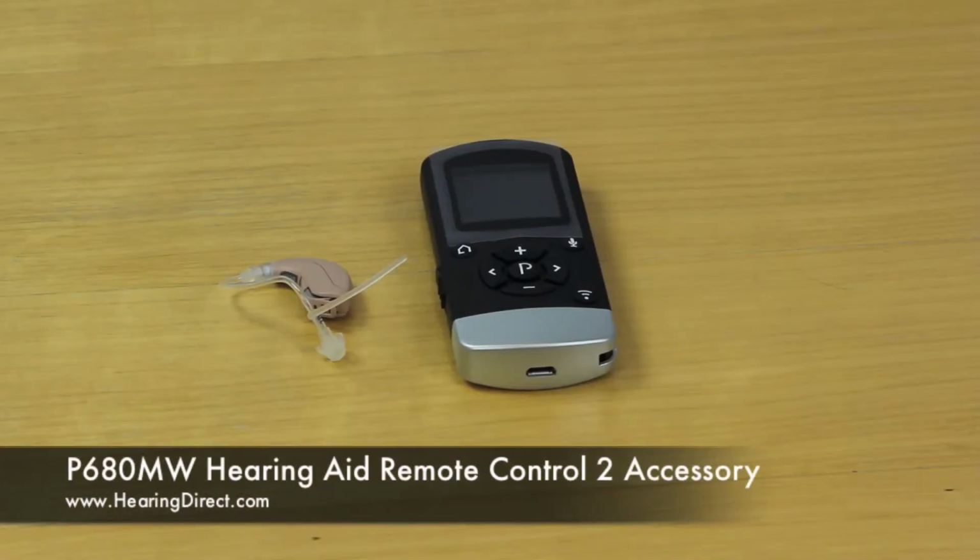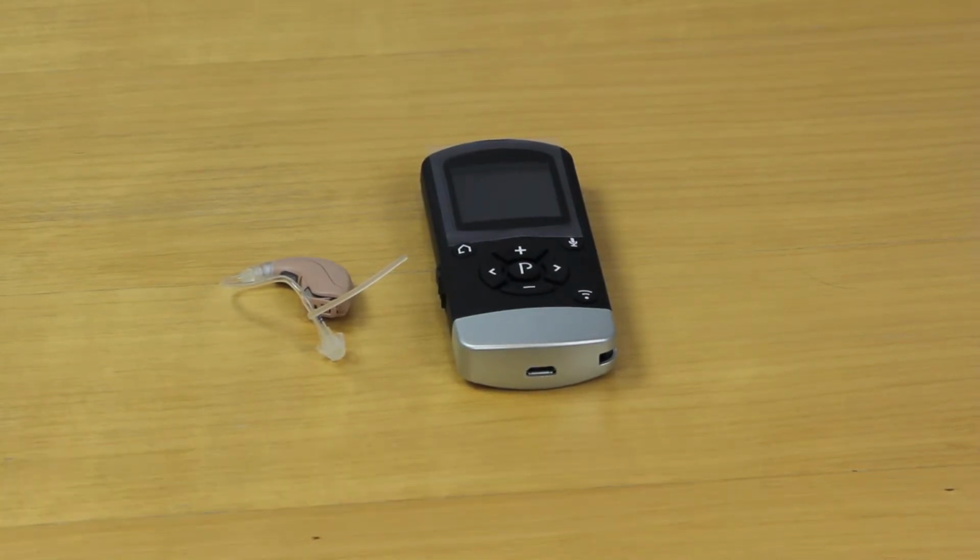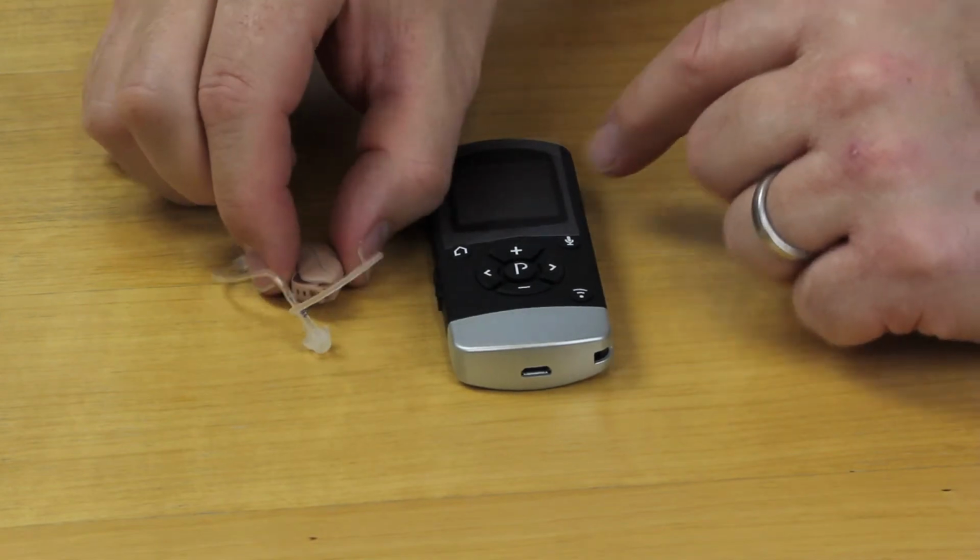You can use your remote control with your hearing aid. You will need to pair them together. Please ensure your hearing instrument is in the off position by opening the battery compartment.